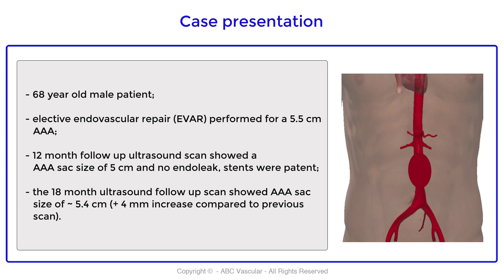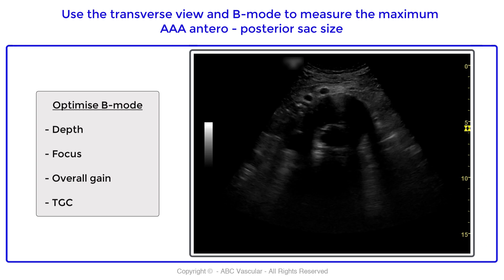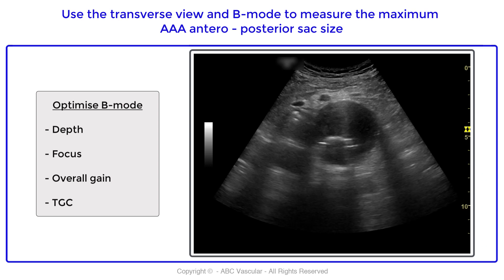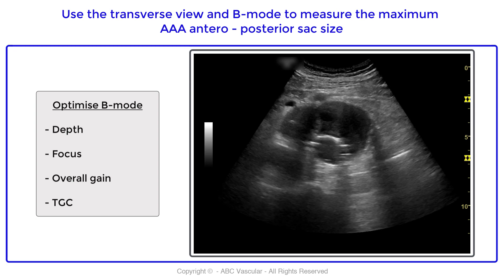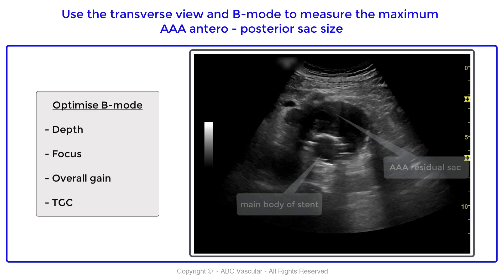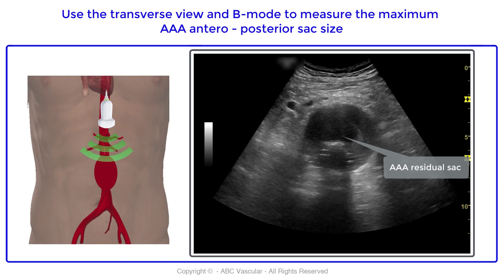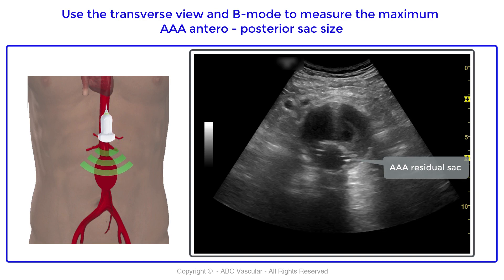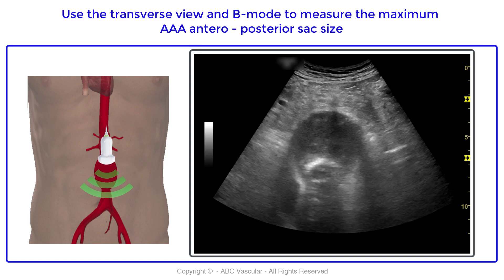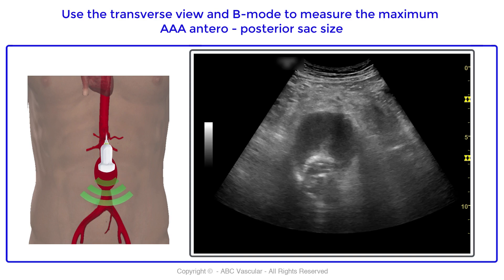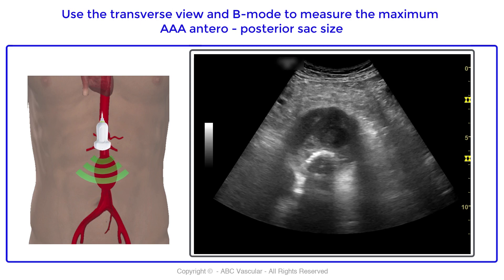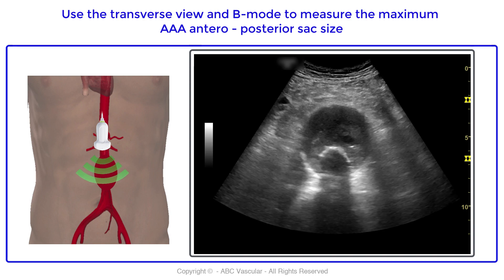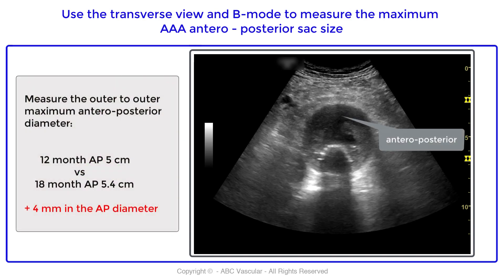The first step when examining an endovascular repair for abdominal aortic aneurysm is to perform a B-mode overview. We optimize all B-mode parameters and move the transducer across the aneurysm to identify visually the largest aortic diameter. Once identified, we freeze the image and measure the outer-to-outer maximum anterior-posterior diameter, which in this case measures 5.4 cm.